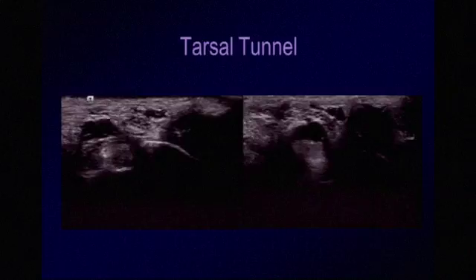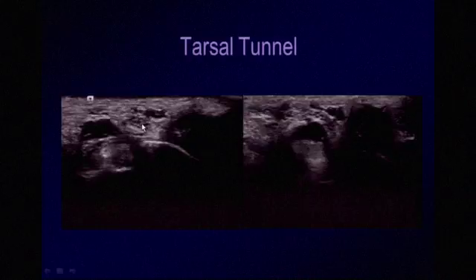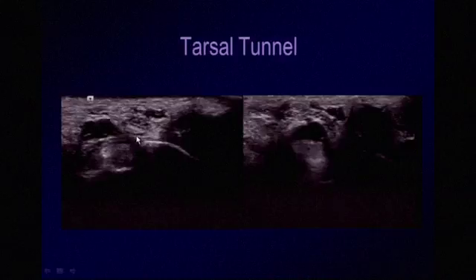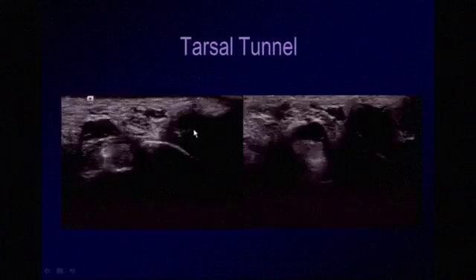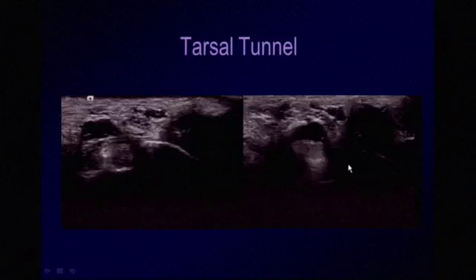The tarsal tunnel is an area where the nerve can become entrapped — analogous to carpal tunnel syndrome, where the median nerve is entrapped, here we are looking at entrapment of the tibial nerve. Here we see an anechoic to hypoechoic multilobulated structure in the region of the tarsal tunnel — this is a ganglion cyst. This patient felt pain especially when flexing their foot; with change in foot position, the ganglion shifts medially and compresses the adjacent tibial nerve.